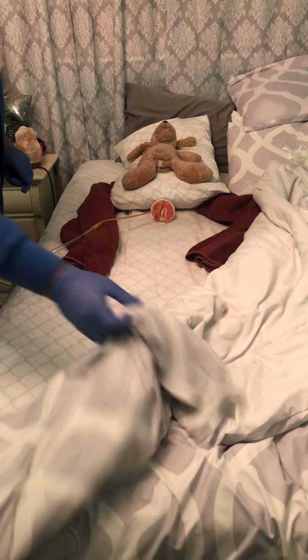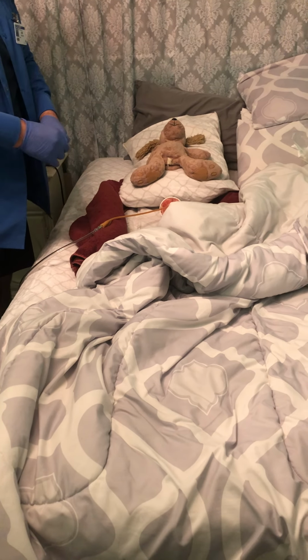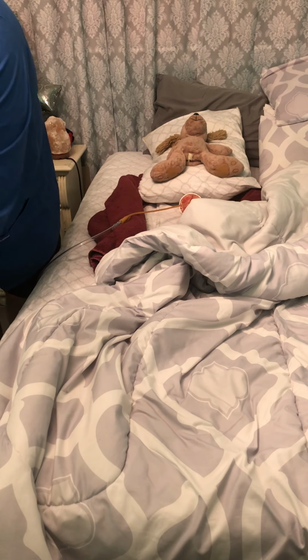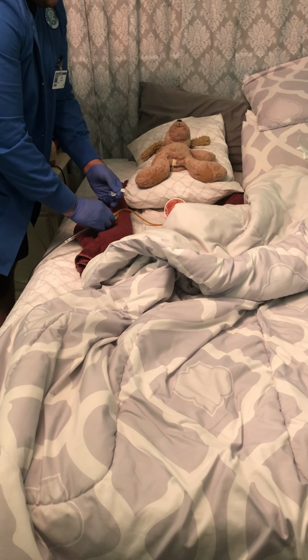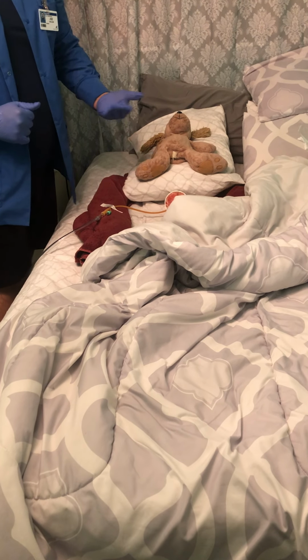And then just cover the patient up. Oh, before we do that, you want to tape or secure with some kind of device the Foley to the patient's leg, just so it's not constantly pulling on it or giving it any tension.